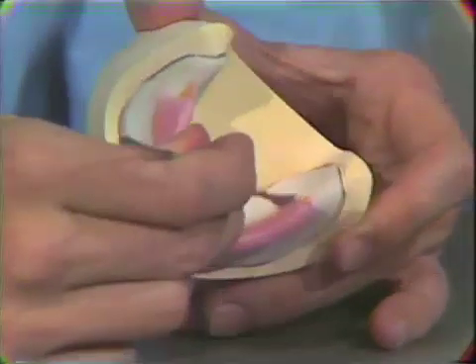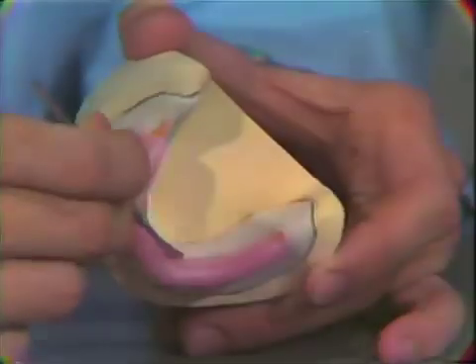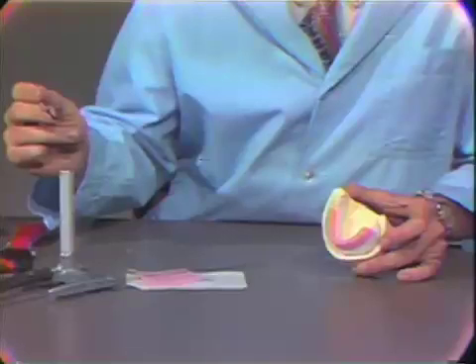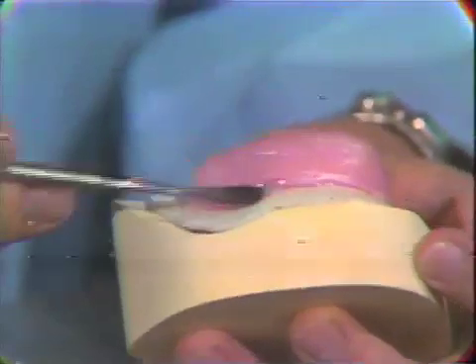Now the wax is sealed to the base plate, following around on the lingual and sealing it with the hot end of the number seven spatula. Again, we seal on the buccal and follow around into the labial region.